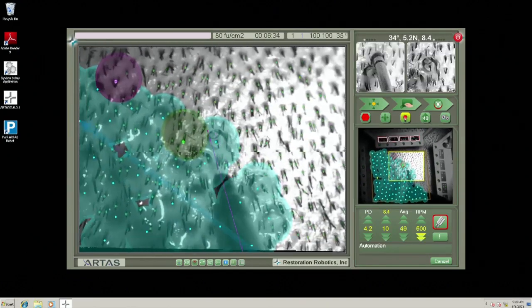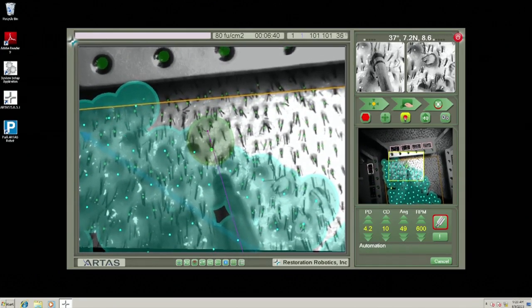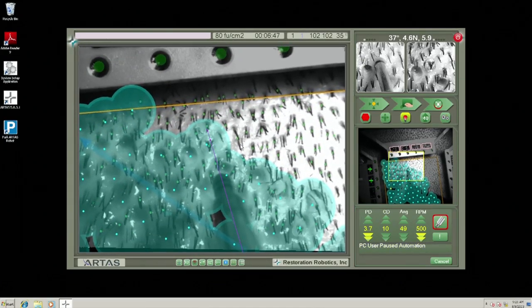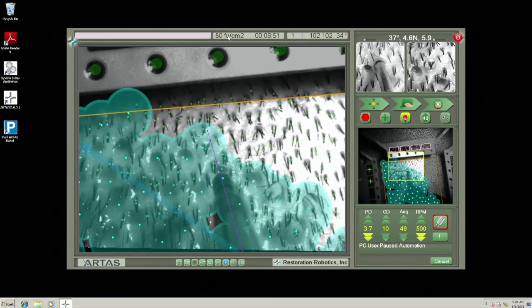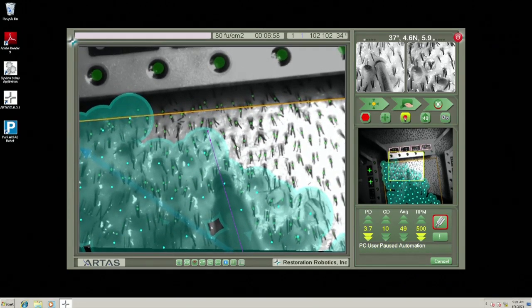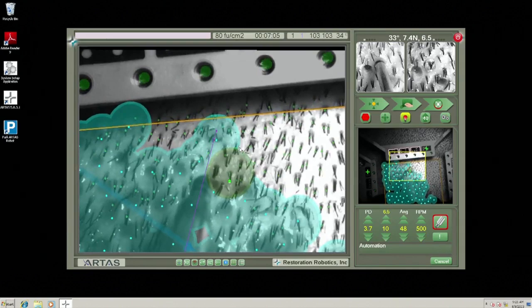And occasionally, if they do, where we've left some hairs erroneously, left them a little long, like this hair here, you can see this hair is registering. I'm pausing it so you can look at this. But if you leave it too long, this hair and this hair register as one hair, and that number will drive down your density that's being measured, and it'll drive down your ability to efficiently harvest and yield different grafts. So you want to make sure that you minimize this type of phenomenon. You don't see it very often, but at least it allows you to be more aggressive in that area.